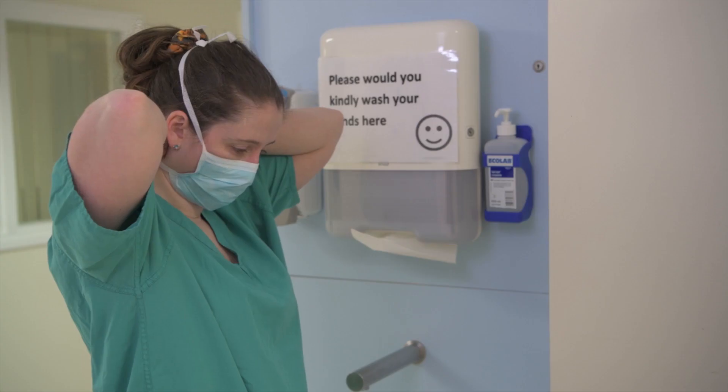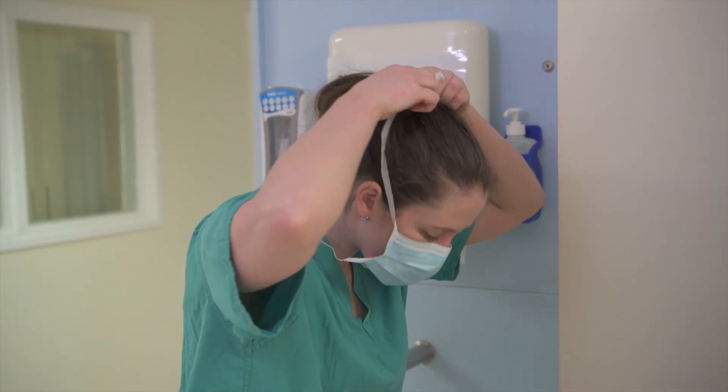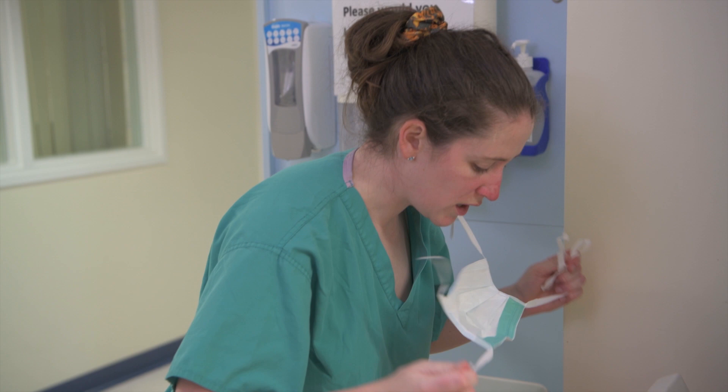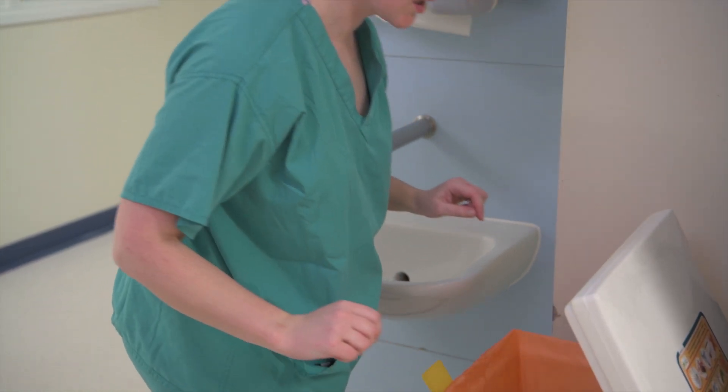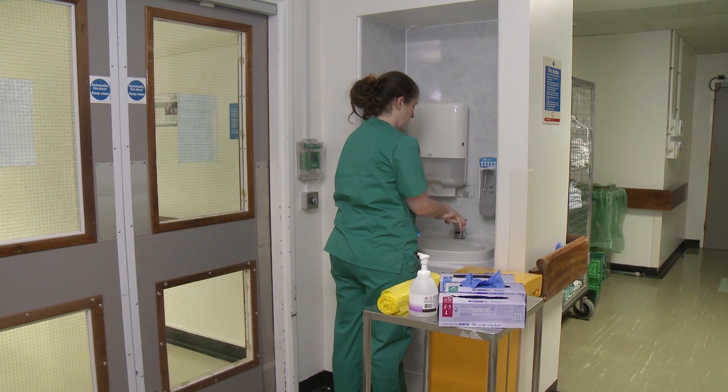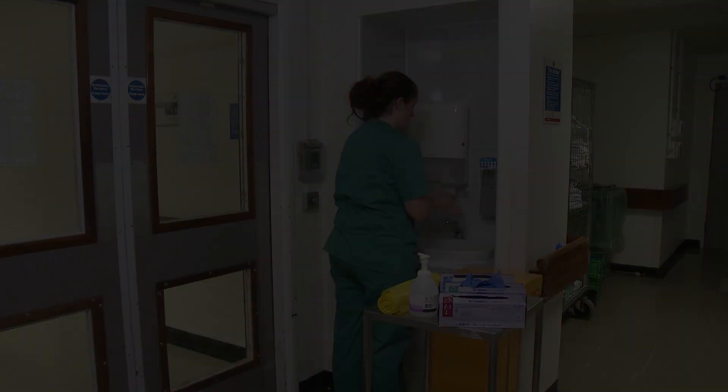Remove mask. Untie or break the bottom ties. Then untie or break the top ties and remove by handling the ties only. Discard as clinical waste by leaning forward slightly.